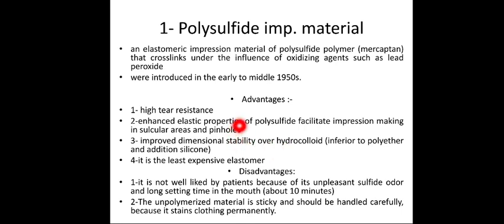The advantages is the resistance to tear, easy to be used, have some elastic properties, impression is made easily, can be used in undercut and pinhole area.